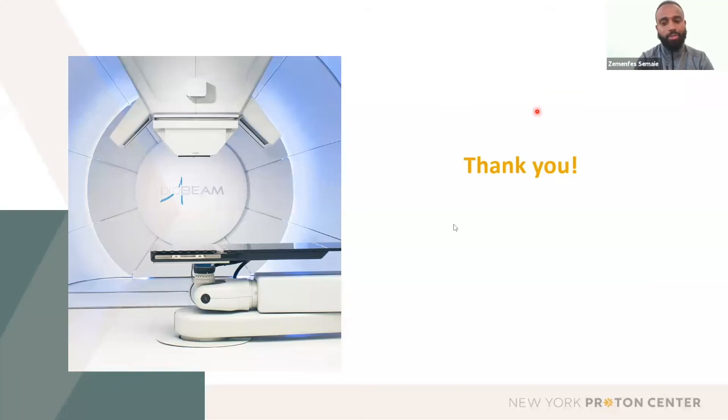For sure. Oddly, you would think maybe adults understand the system better, but these days, children are pretty savvy as well when it comes to the technology. So at Inova SHAR, we have a guide that we send to patients even prior to their simulation, so they can use that tool to practice. It's very similar to playing a game. It's essentially using just the arrow up and arrow down to play around with the system.